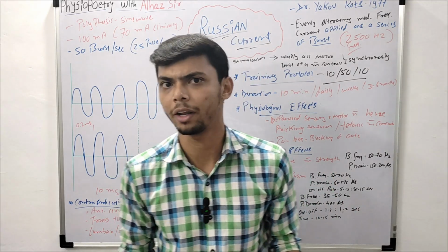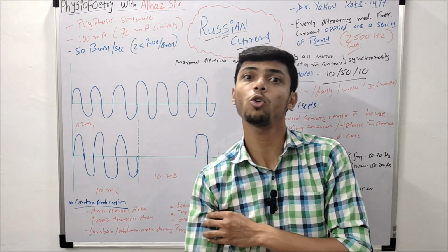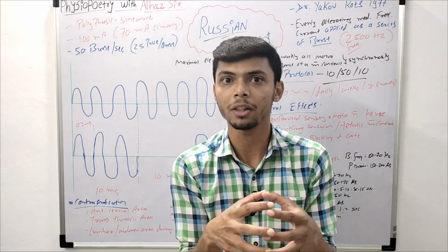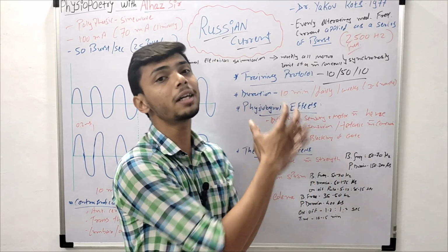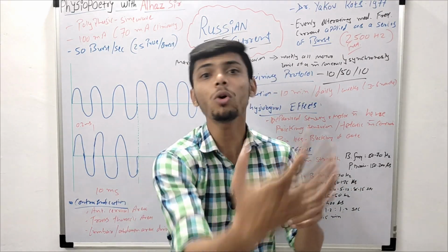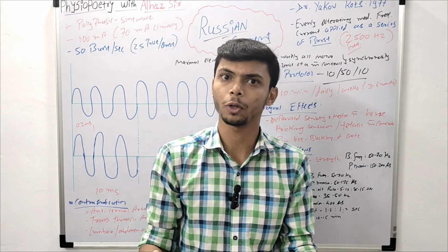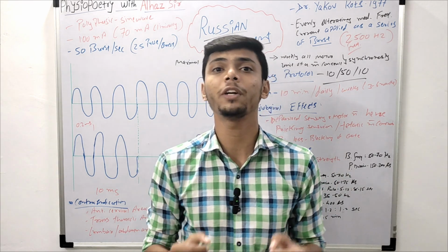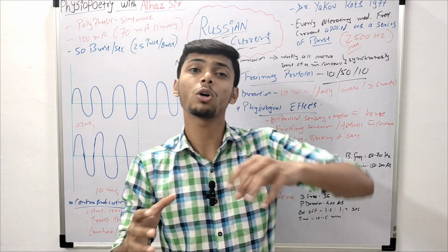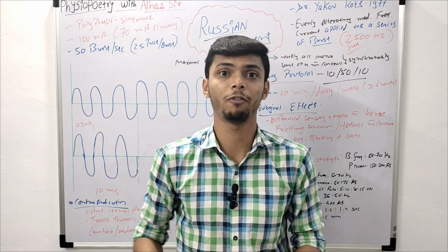When we do strength training, when we are strengthening a particular muscle, what do we do? We strengthen that muscle, we contract that muscle. So by using that contraction, the muscle is getting strengthened. So वही सेम चीज हम यहाँ पे करंट के थ्रू कर रहे हैं. We are applying the same amount of impulses, slightly more amount of impulses, so it will stimulate all the motor units, almost all the motor units. Now if all the motor units will fire in a synchronized way at the same time, it will cause more contraction, which is more than is physiologically possible for us to do.